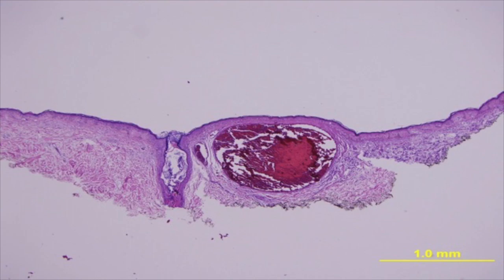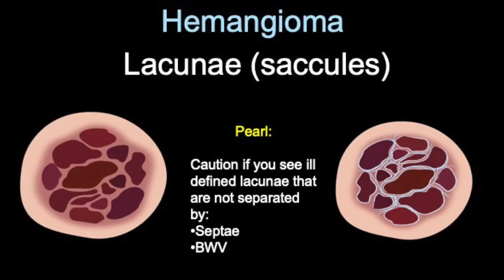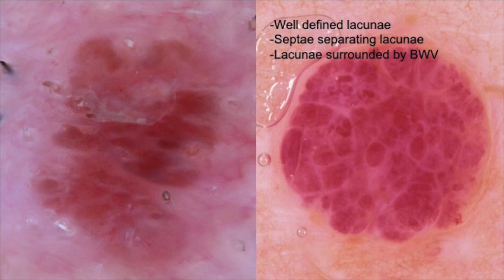So you know that these are vessels that are pushing the stroma apart. And the histology of an angioma. Now, why make this distinction or why is this stroma important? So that's an angioma when you know that they're discrete dilated vessels. But if you start to get these structures that are reddish, but you can't actually know whether they're truly an isolated large vessel with intervening stroma, they're actually not called lacunae. They're called milky red globules. And milky red globules is a feature of nodular melanoma. Okay, that's an angioma, that's a nodular melanoma. Do you see how they differ?